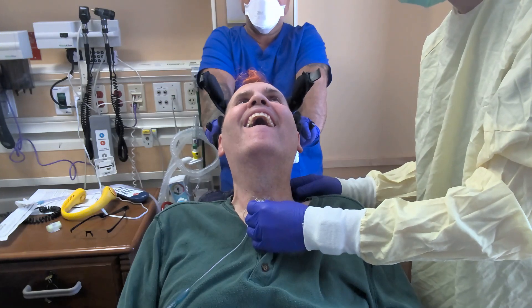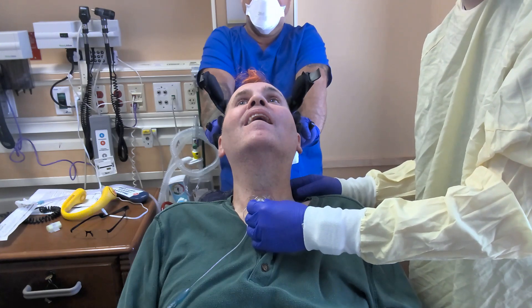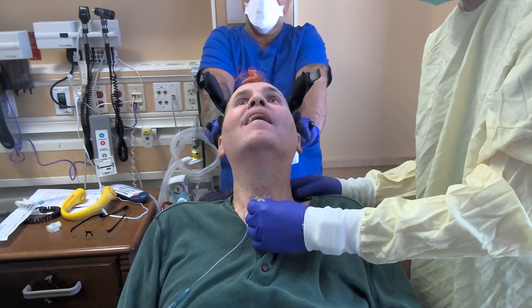How's it going? Do you guys have syringes around? What kind of syringe? 10cc. Like normal saline? No, just air.